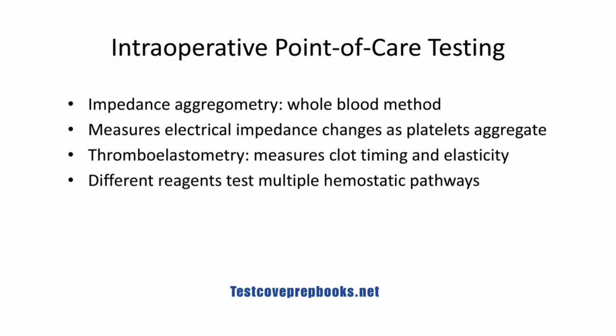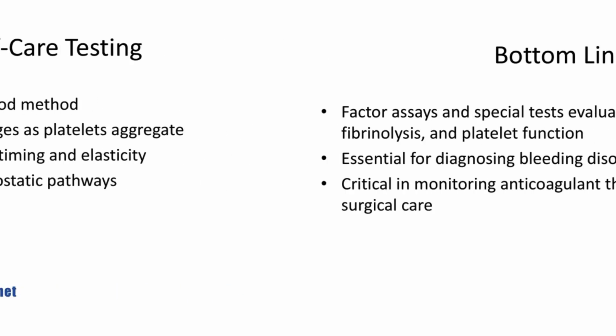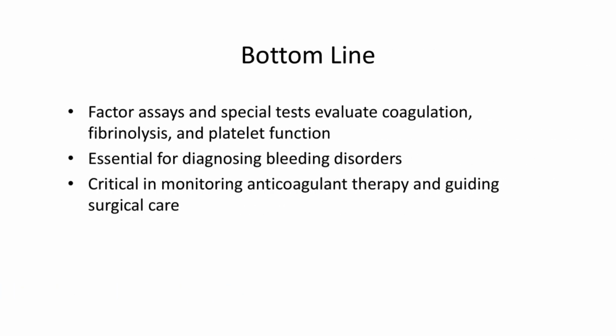Different reagents and agonists can be used to test various hemostatic pathways. The bottom line? Factor assays and specialized tests provide detailed evaluation of coagulation, fibrinolysis, and platelet function. They are critical in diagnosing bleeding disorders, monitoring anticoagulant therapy, and guiding surgical management.